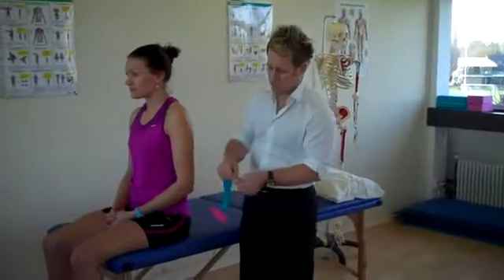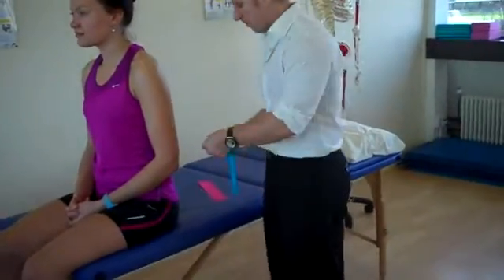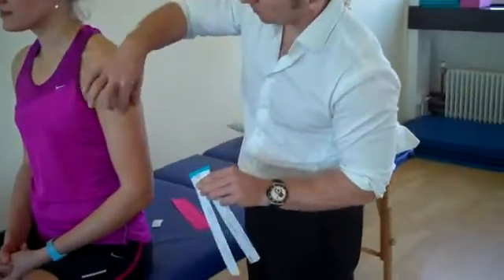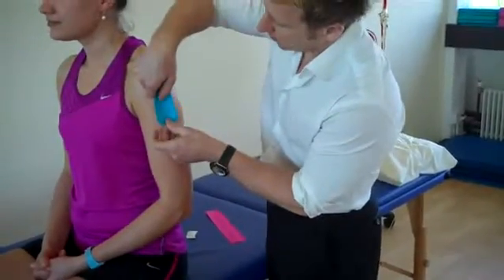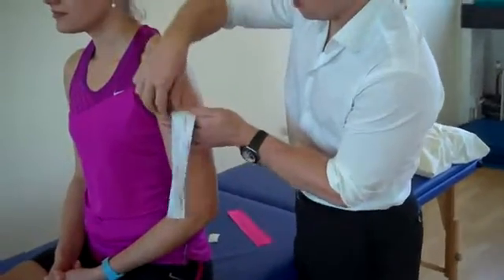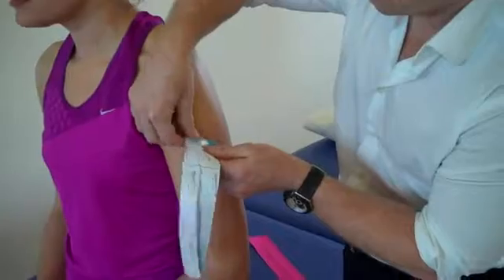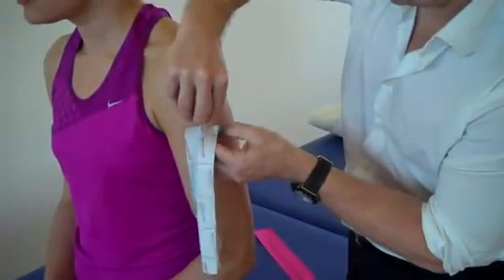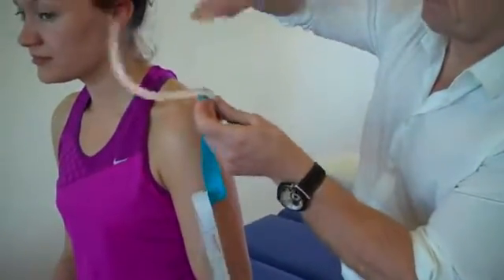So first for the tape — split the tape towards its end where we have no stretch on the ends, and where the deltoid comes down to the insertion of the tuberosity. We're going to apply the first piece of tape onto the tuberosity with no stretch, and then feed off one leg at a time.